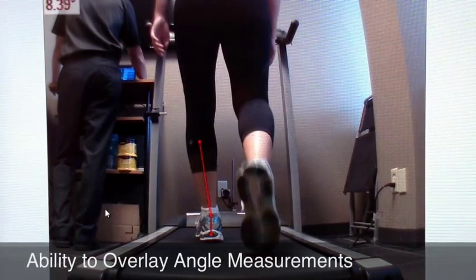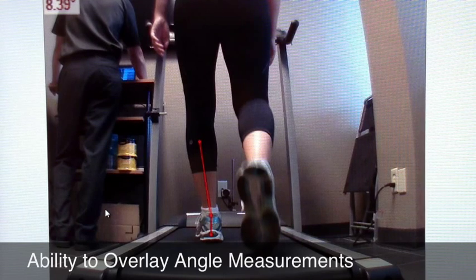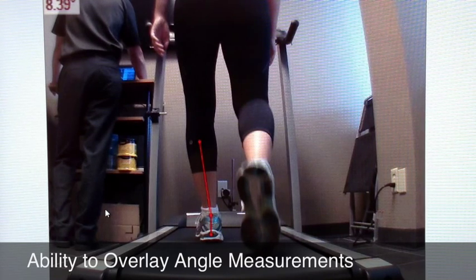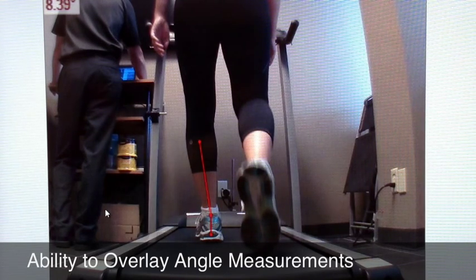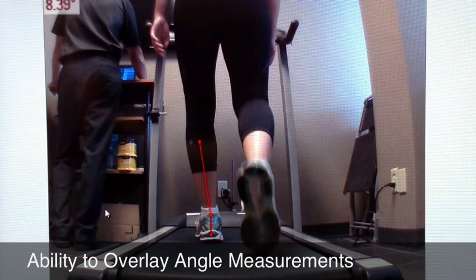The software also has the ability to use visual aids such as angle measurements that can be overlaid on the videos to measure, for example, the amount of rear foot pronation present.